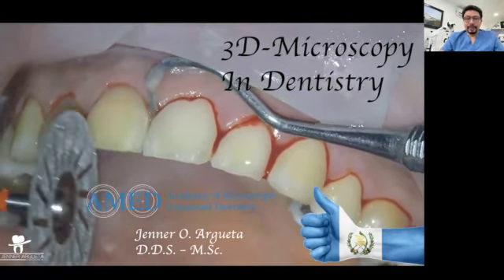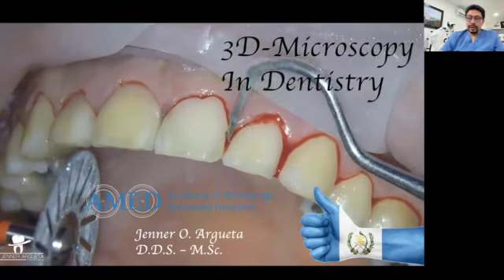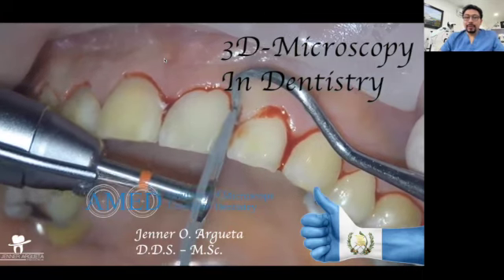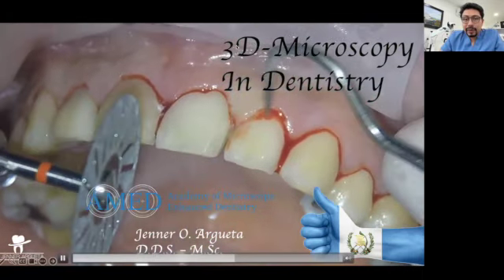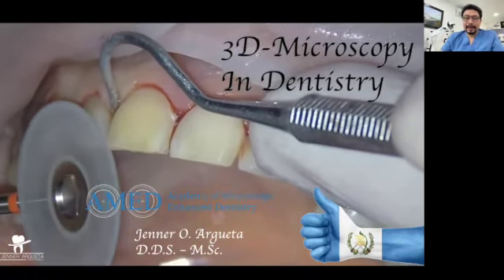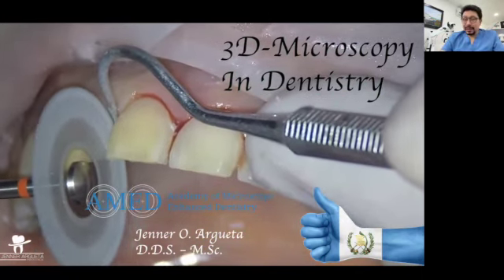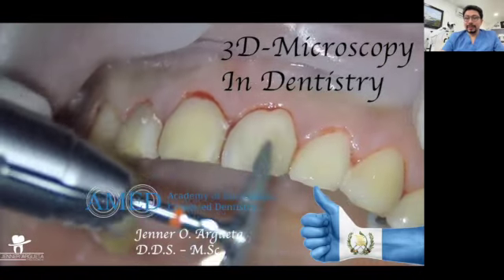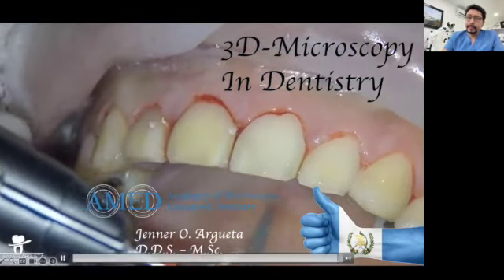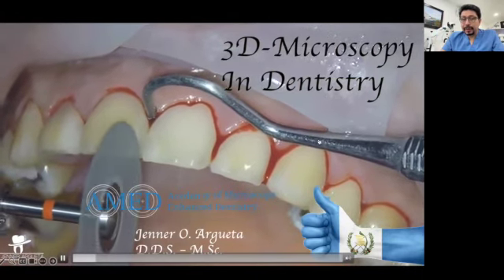I'm an endodontist, but my clinical practice is not only focused on endo. I also do some restorative and some prosthetic procedures. And when working in the most posterior areas, for preparing a tooth for a crown, for example, the visibility in those areas might be compromised, and the illumination and the magnification that the microscope can provide are essential tools for having a reliable clinical practice.